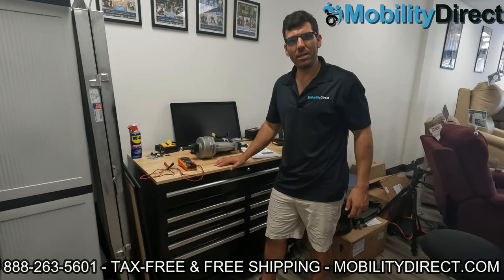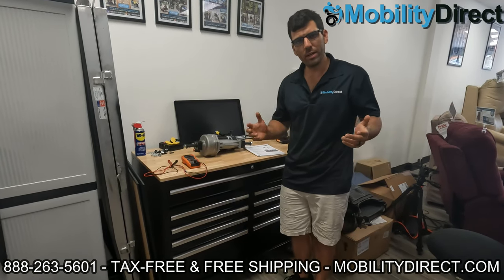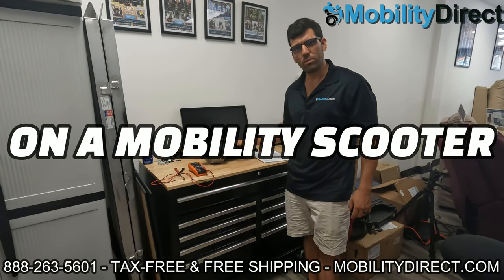Hi everybody, I'm Sergio with Mobility Direct, here with another troubleshooting repair video. Thanks for joining us. In this video, we're going to show you how to test a faulty braking system on a transaxle motor.